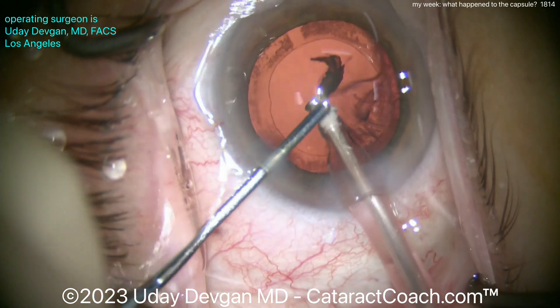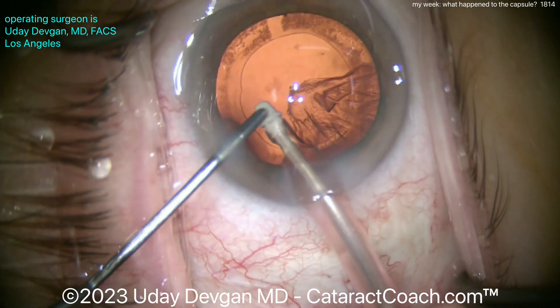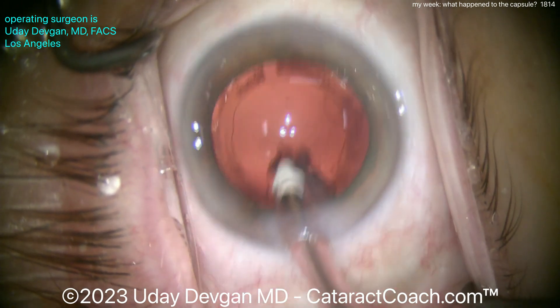That looks pretty good. Now you saw the title slide, so you know there's going to be some capsule issue. Let's see what that is. Here's the rest of the cortex being removed, and now the sub-incisional cortex will remain — that's a little bit more tricky — and we're getting that out.